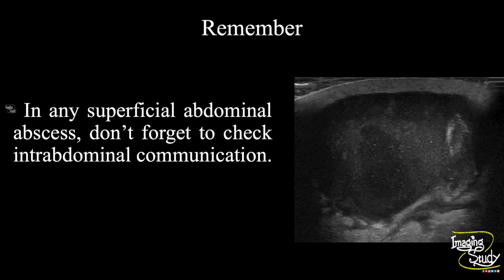Now the take-home message. In any superficial abdominal abscess, don't forget to check intra-abdominal or intraperitoneal communication.